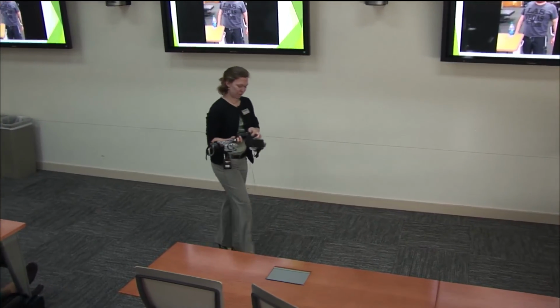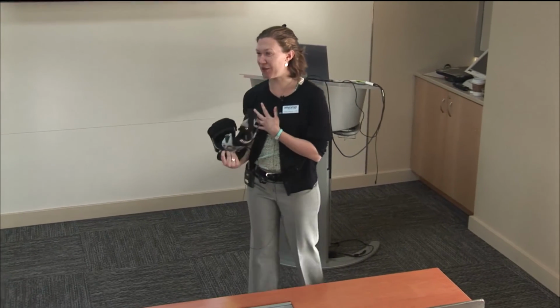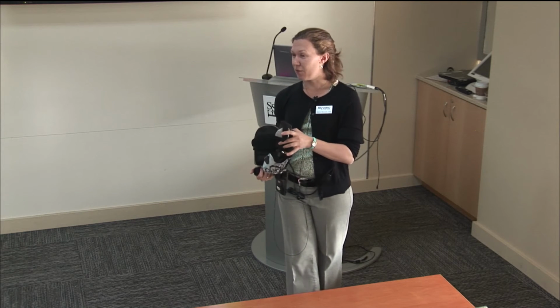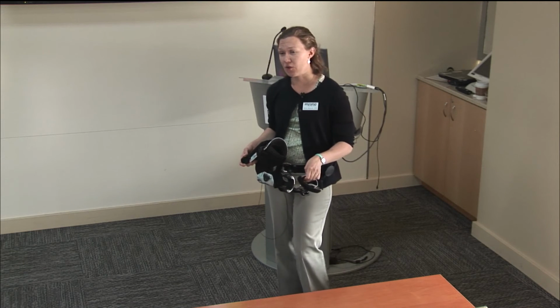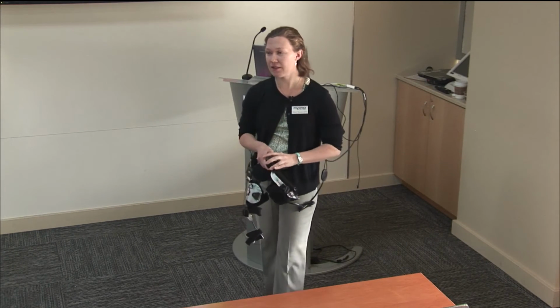The one question I had: since these patients all have neurologic deficits, shouldn't the shoulder harness be the rule rather than the exception? We do find that probably about 80% of people do need a shoulder harness. So our recommendation as the manufacturer is that you probably should fit a shoulder harness on almost everybody. However, we do accept that practitioners themselves have the ability to make that final call after assessing the patient. It is an extensive assessment. The assessment itself is about 14 pages or so that your O&P provider will do to ensure that this is an appropriate candidate and that they are meeting that patient's needs, whether that is what type of wrist unit they need, a harness, terminal attachments, all of those sorts of things.